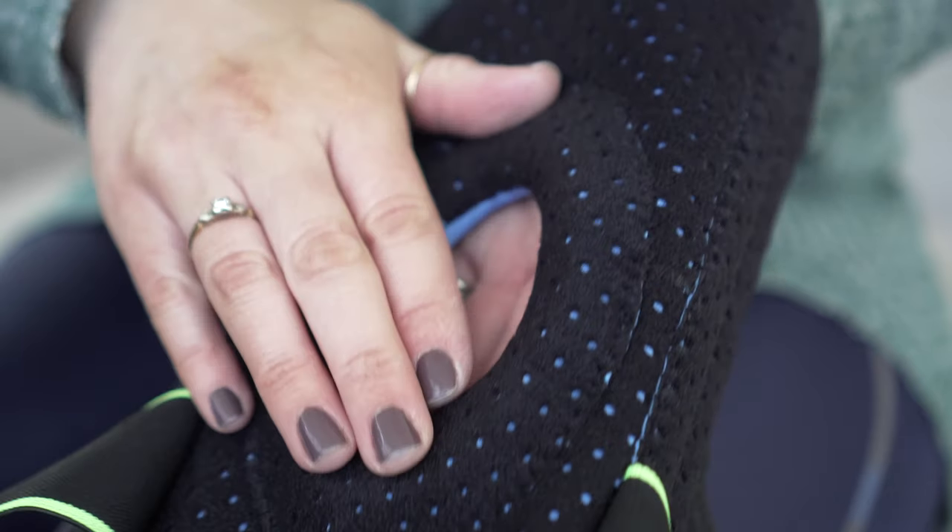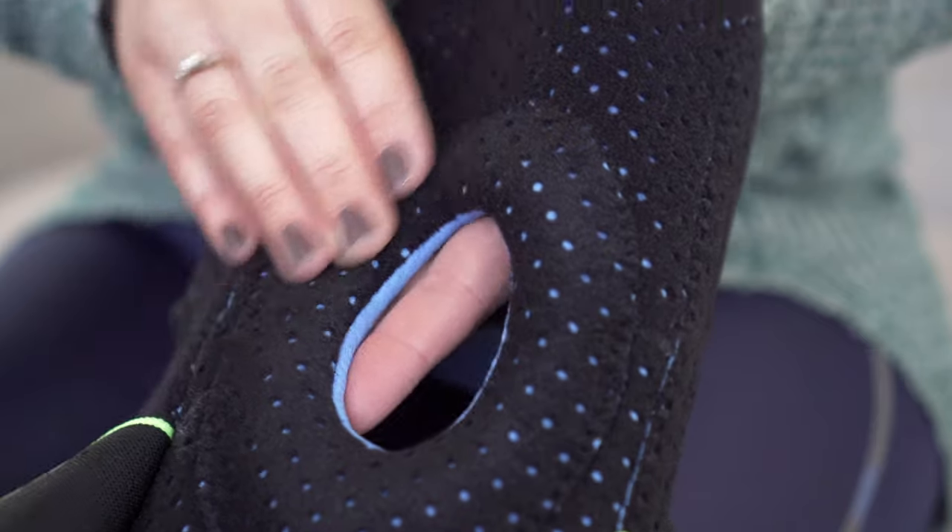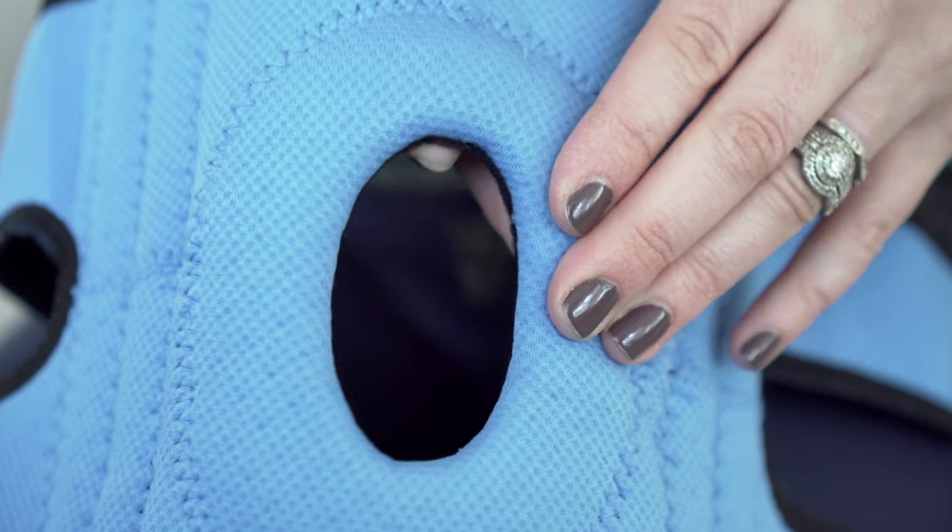The biggest benefit is probably the open patella design with the gel pad inside, and this is going to provide you with the relief that your sore knee needs as well as giving you comfort while you're wearing it.